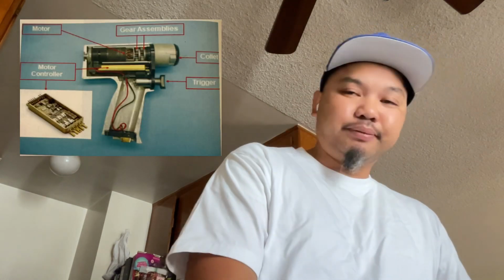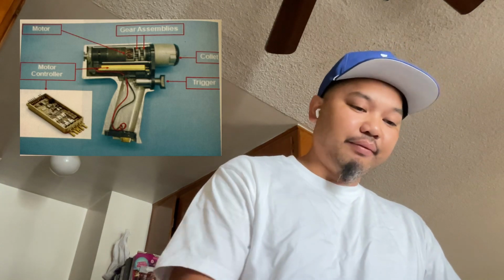I'm going to show an image right here. That's basically what a drill looks like internally. So you want to make sure you use the correct manufacturer guidelines, the IFU, the standards, when cleaning it, so you don't possibly get those components wet or possibly rust the internals, and then watch that drill not work. Power surgical instruments contain several working components that will be damaged if fluid such as water or a solution is submerged within that drill.